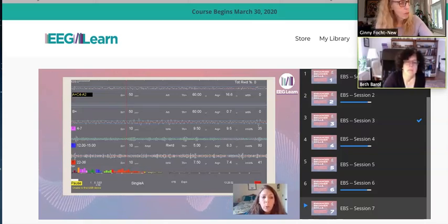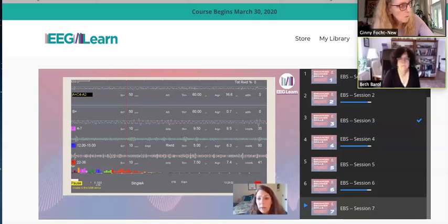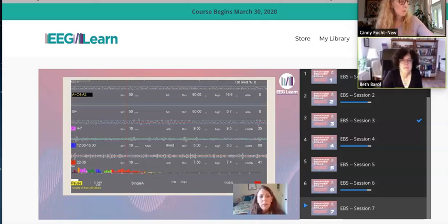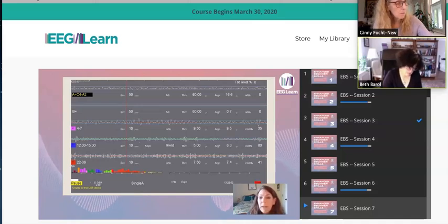And then when we look at the 12 to 15, you only need about 5 or 6 microvolts of 12 to 15 hertz activity, and they've got 6.3. So that's pretty good. That's right where we like it to be. And then the 22 to 36, it's just a little bit higher than we might want it to be. So if I was training this person, that would be the focus of my training.